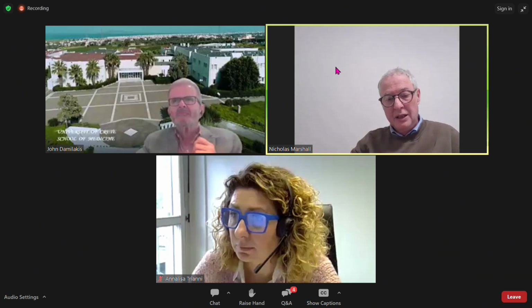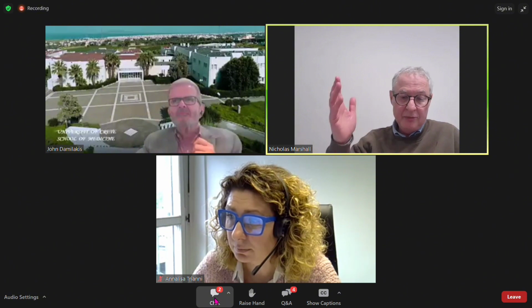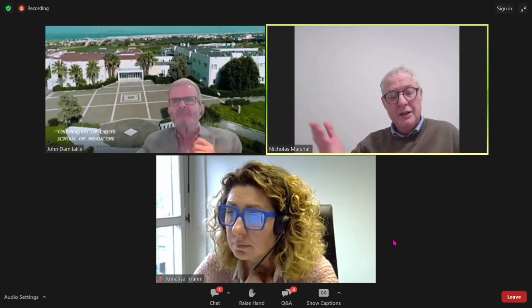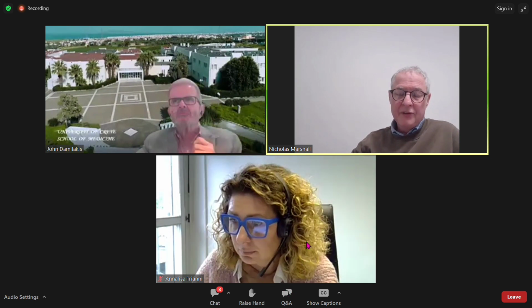As you increase the dose, reduce the noise, increase the penetration, and improve the contrast in the image, you will start to be able to perform the task with increasing success.